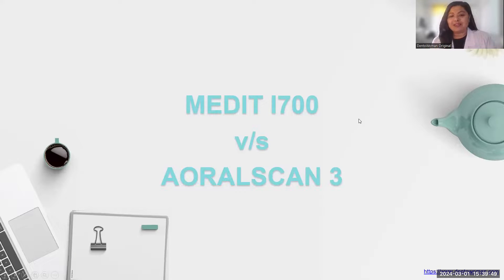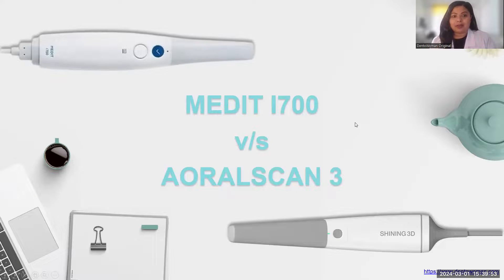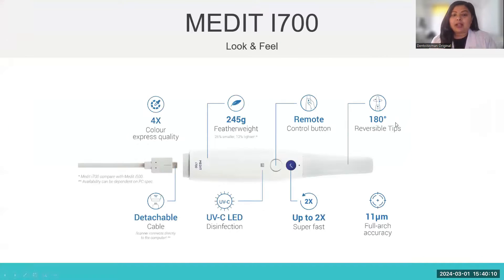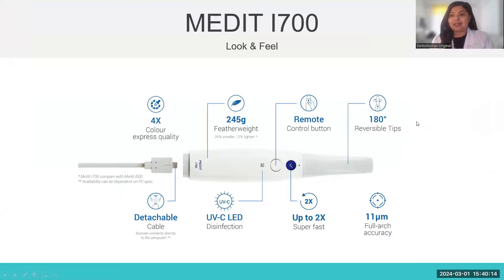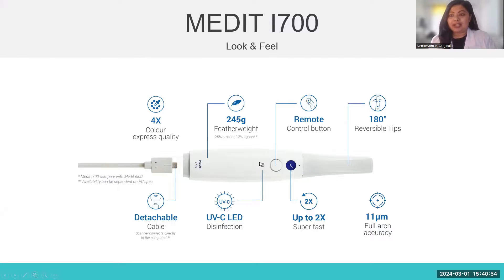Let's begin with the overview of Medit i700 versus Oral Scan 3. In terms of overall design and look, both scanners look similar and weigh almost the same, but there are a few small yet significant differences. Looking at the Medit i700 first — from my honest hands-on experience — it has a remote control button right below the scanning button, and while scanning I accidentally pressed it so many times. I really wish Medit had placed that button somewhere else.